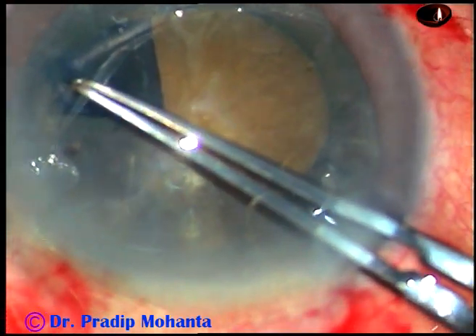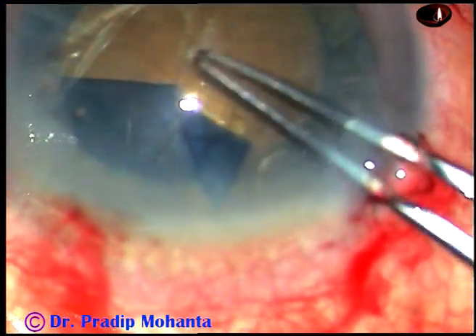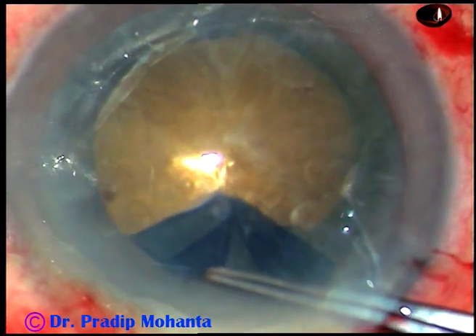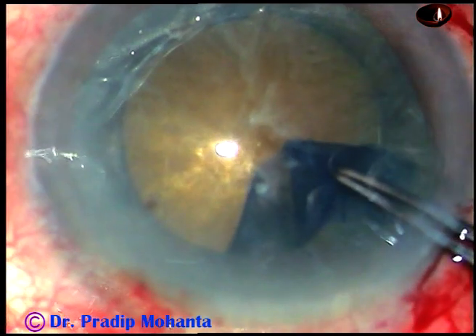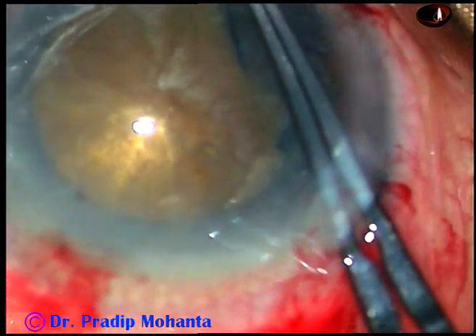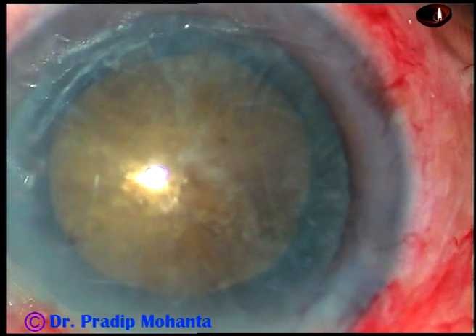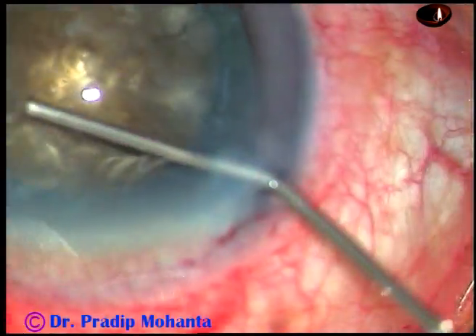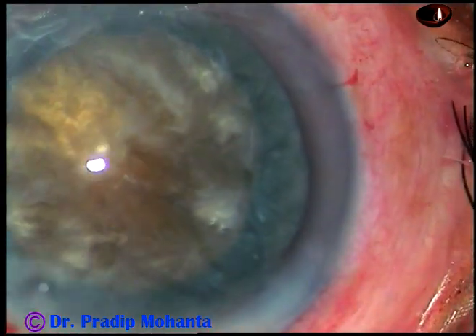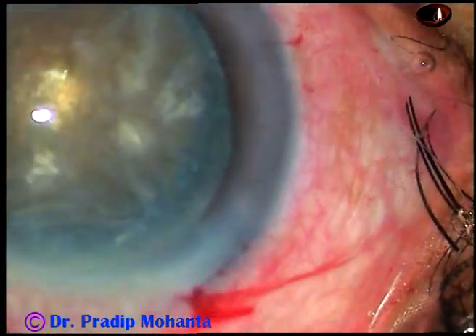My aim is to do a large rhexis. I find that the rhexis is adequate but not very large — the size is about 5.5 millimeters. My expectation was to make a rhexis of about 6 millimeters.